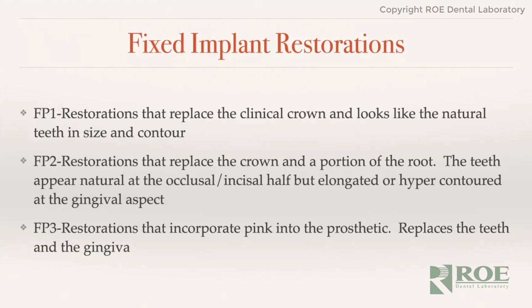And when we send the patient back to the finance office, if we show them pictures of an FP1 versus an FP3, and they choose the FP1, or they're only a candidate for the FP3, the financial office needs to know what to charge and how to charge it in.